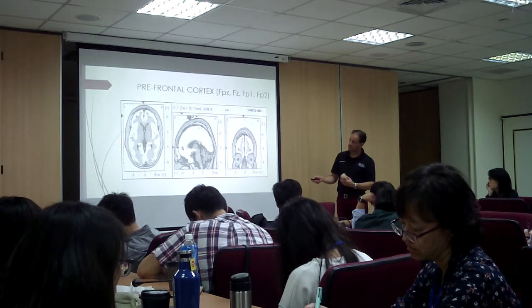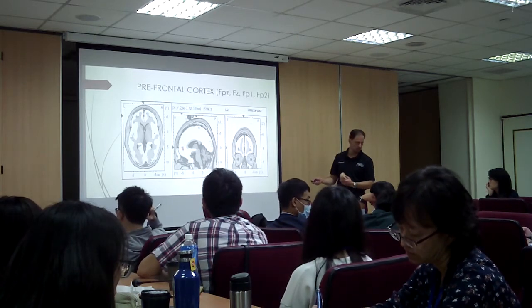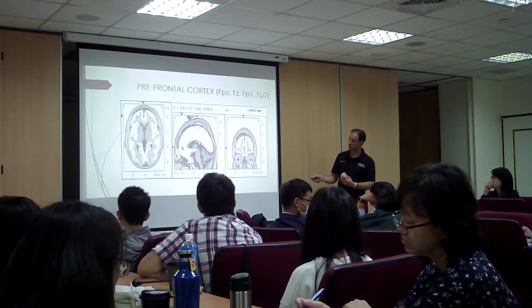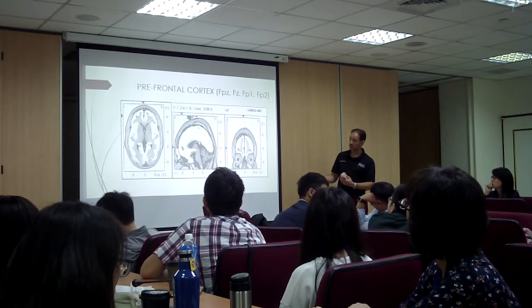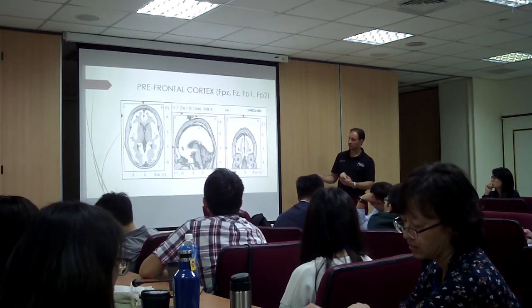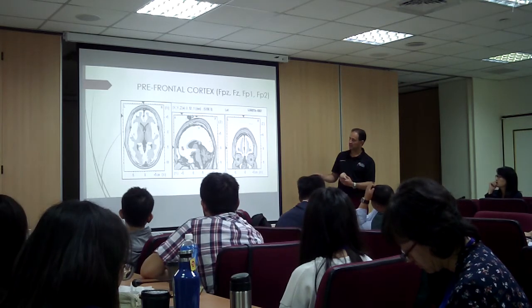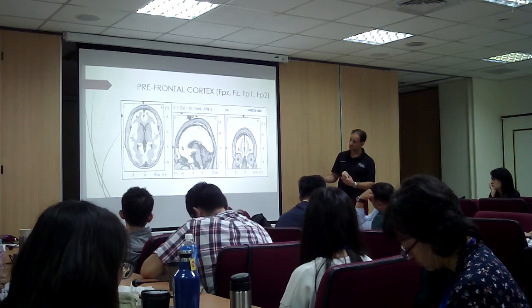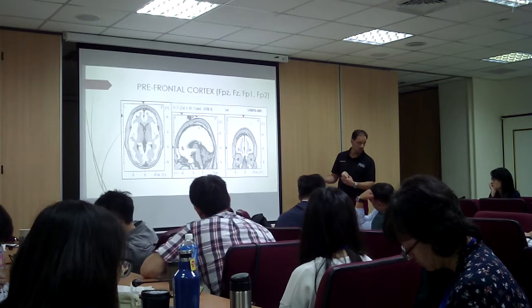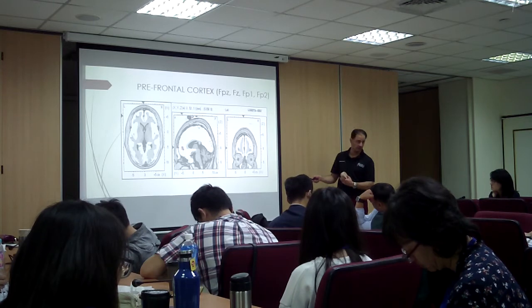This is the LORETA map for somebody with depression. Look at that. It's the affective processing center in the anterior cingulate cortex that's not working well. For some people, it will light up here and it will light up here. So it means I think, therefore I get upset. I think, therefore I get obsessed. I think, therefore I get depressed. So for this person, the depression is more on the emotional and affective side of things. There's not a whole lot of cognitive processing going on, but the affective regulation is the most salient and problematic area. Okay?